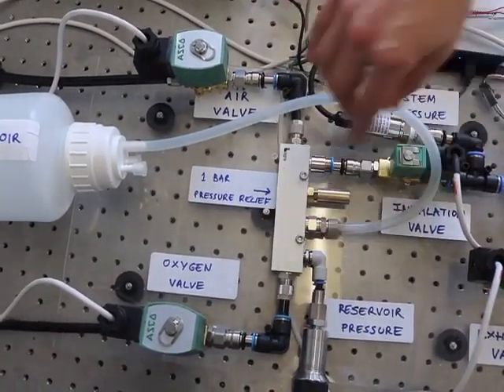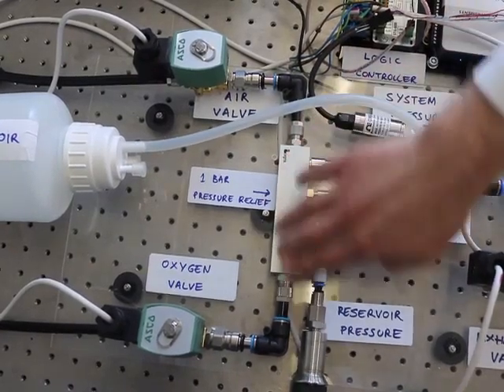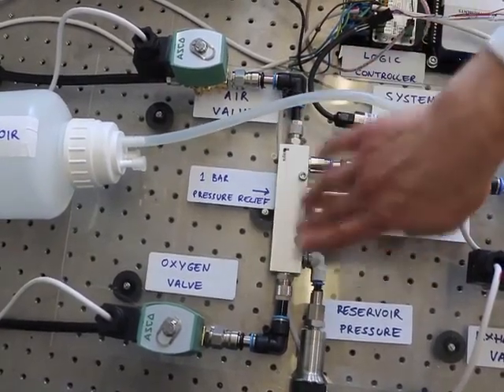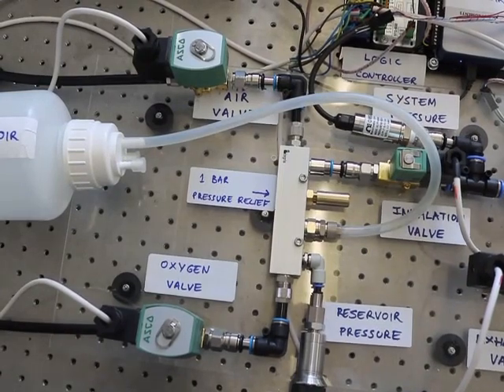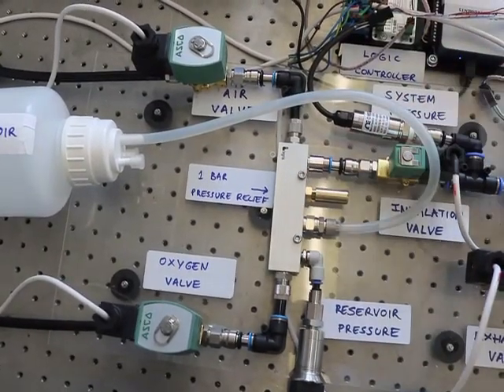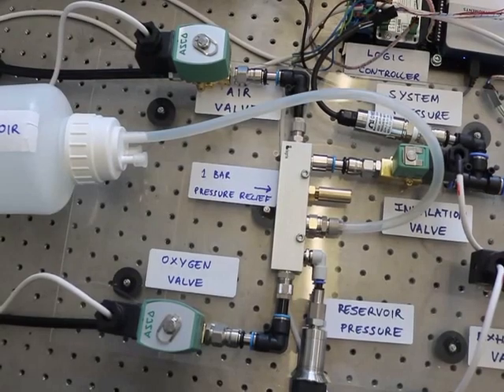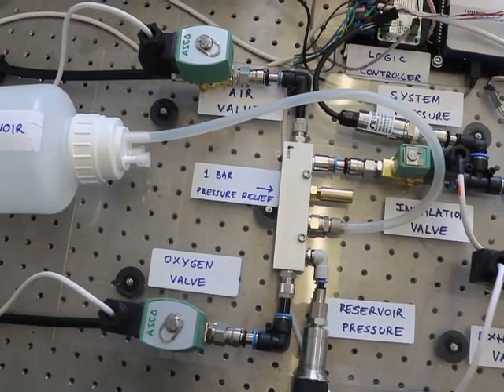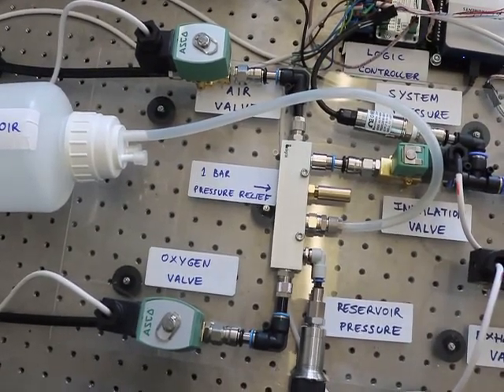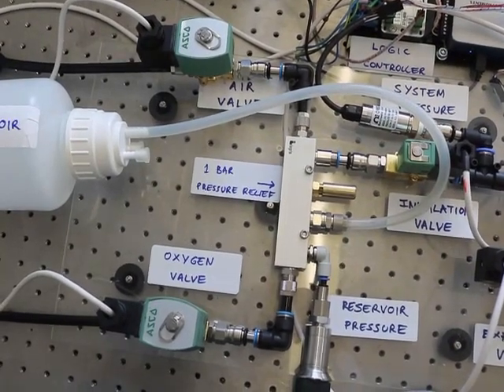So these valves are connected to the reservoir by this manifold here. This just has basically open pathways, so they're all connected to the same bit of gas. Here we have a pressure sensor. So we use that to monitor the pressure in the reservoir. In the reservoir, we need to get not only the right pressure, but also the right mix of gas. So the pressure sensor allows us to monitor that.